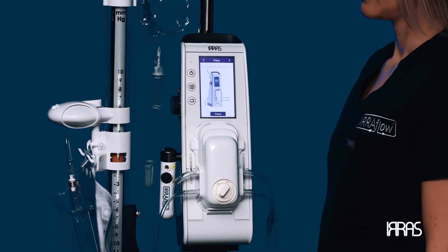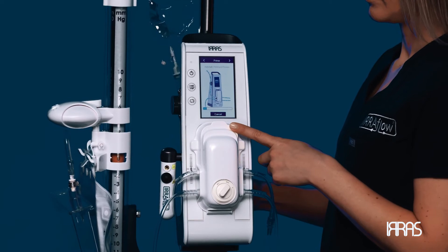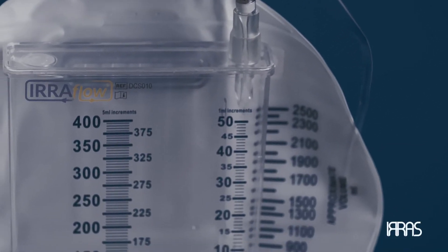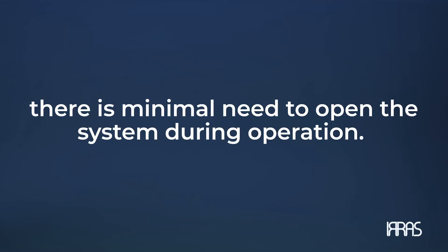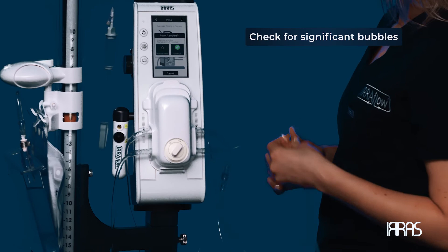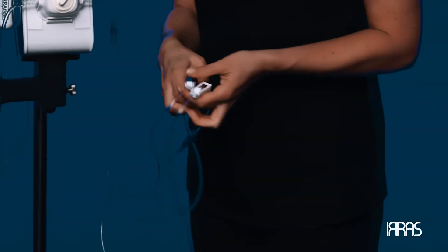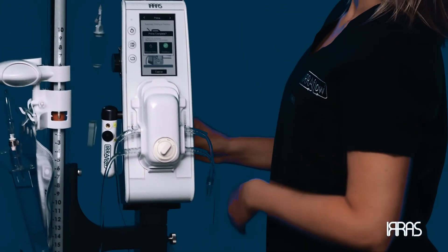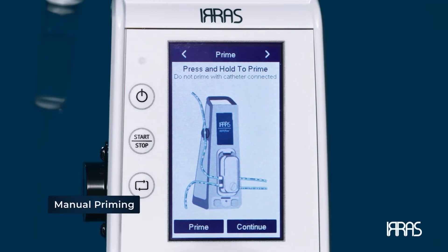Priming. Now it is time to prime the system. Automatic priming will occur after pressing the prime button and will take approximately 45 seconds. You are done priming when you observe irrigation fluid in the drainage bag and the loading bar on the screen is complete. Priming creates a fluid-filled system so that when you connect the tubing to the catheter, there is minimal need to open the system during operation. When priming is complete, check the tubing for significant air bubbles. If there are no bubbles, clamp off the roller clamps on the irrigation and drainage tubing. If additional priming is required, select manual prime and press and hold the manual prime button on the screen.